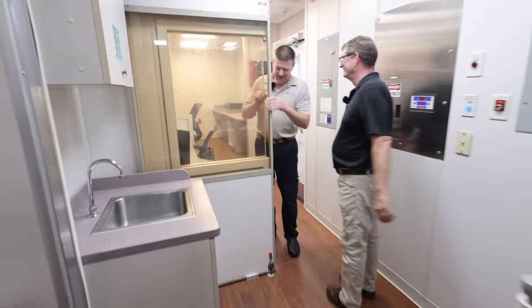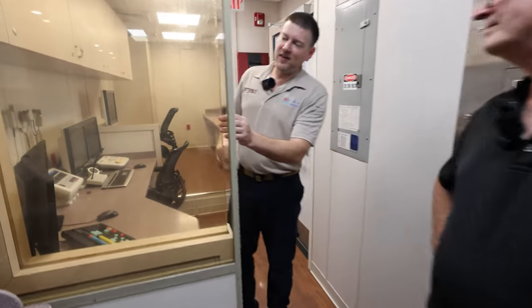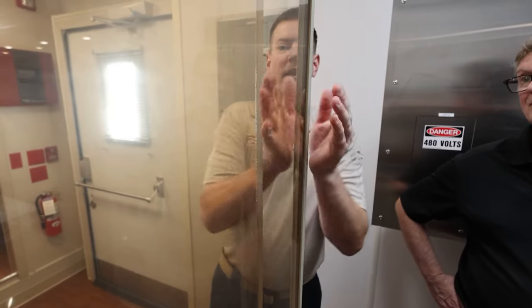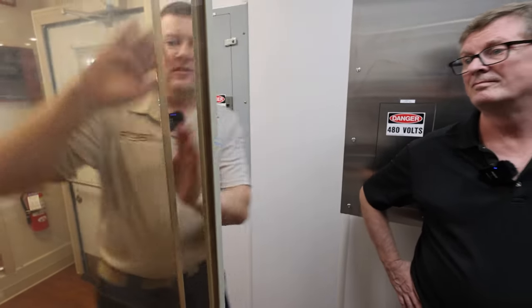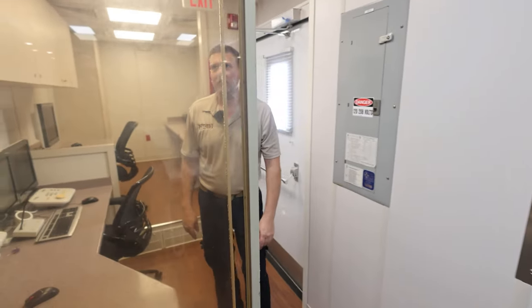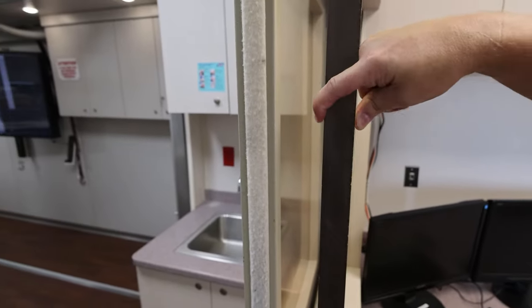Oh, check this out. Oh yeah. Look at this. Leaded glass. You see how thick this leaded glass is? It's an inch and a quarter, I bet. I bet you that's an inch and a quarter. It doesn't appear so on camera, but this pane right here shows you the cross section much more accurately. It's incredible the amount of engineering that it takes to put one of these systems into service. Look at that. Yeah, that's an expensive piece of glass.